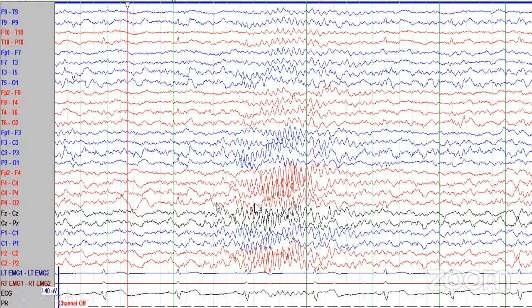On first impression, when we see this epoch, this activity is maximally localized in this region. Now, what is the reason? If we go on to our electrodes, this is basically frontocentral, central, frontocentral. So we have it over the central region and both sides, left and right. So these are well-established sleep spindles.